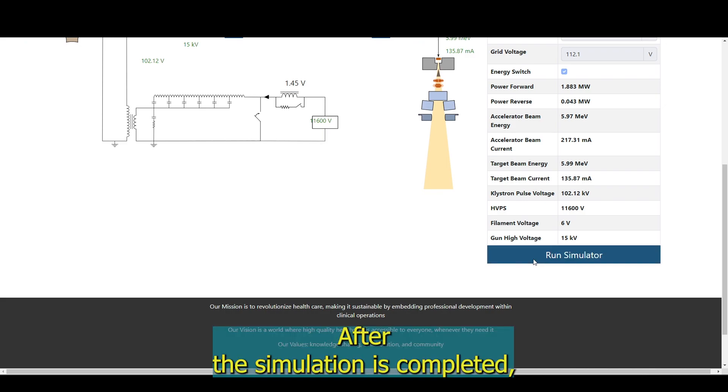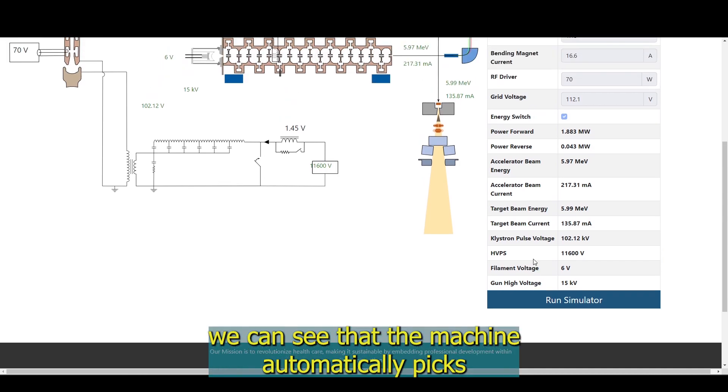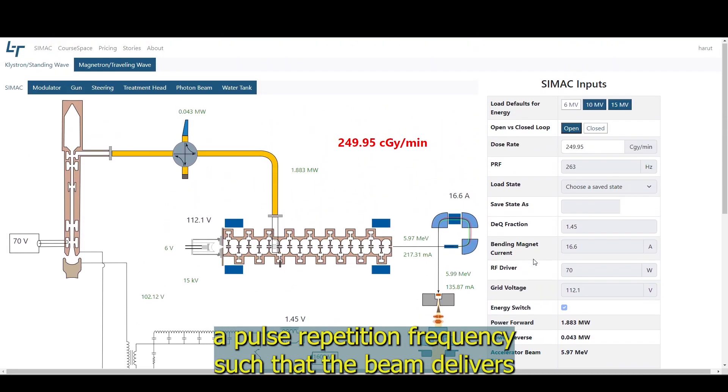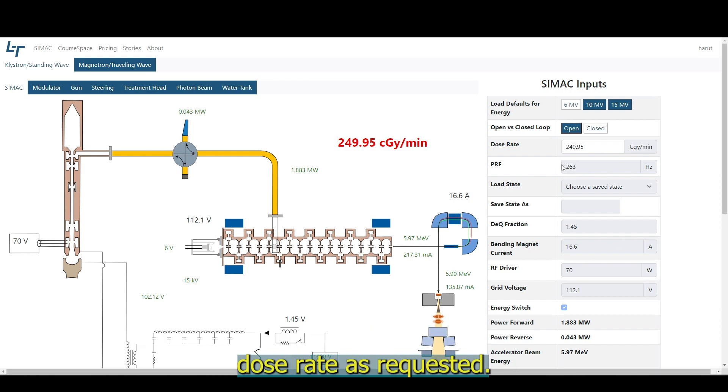After the simulation is completed, we can see that the machine automatically picks a pulse repetition frequency such that the beam delivers dose rate as requested.